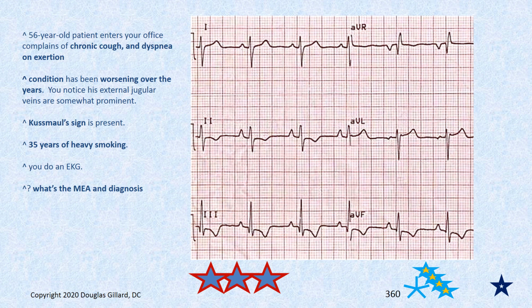What's step one? Well, is the axis normal? We can go through it: is limb lead 1 mostly positive? No. So we immediately know the axis is not normal. What is the axis? Find the... I'm going to make a note here.